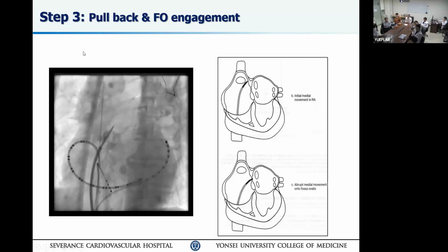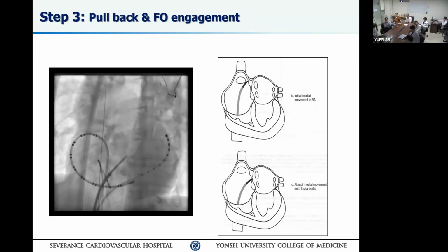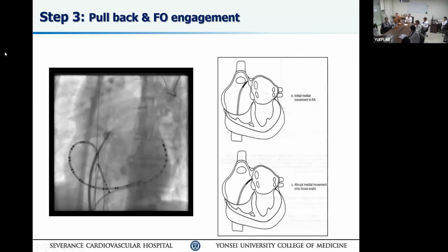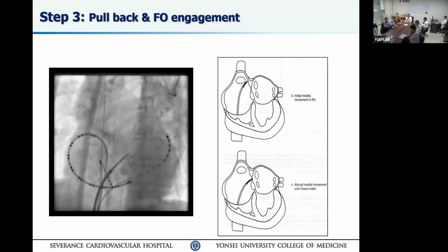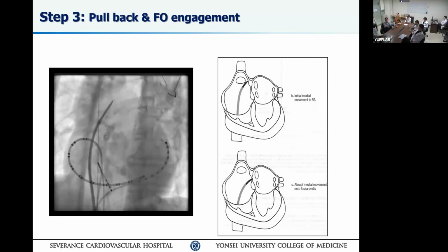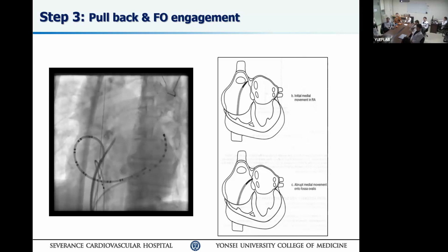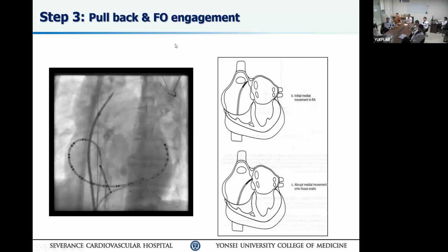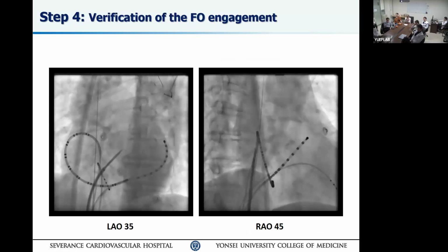Other thing that we underestimate quite a bit is physical examination and chest X-ray. When you want to do this, especially in your country, you don't have intracardiac echo, you don't have any of those. If a patient has, let's say, flat back syndrome, lordosis, your left atrium is going to be deformed. So you're not going to be able to do this normal technique. Similarly, kyphosis, scoliosis, all this is different. So you examine your patient first, and chest X-ray. That's very helpful. Okay, keep going down.